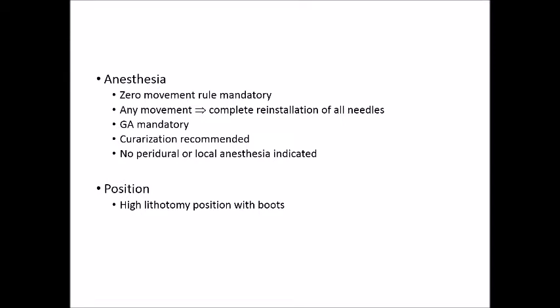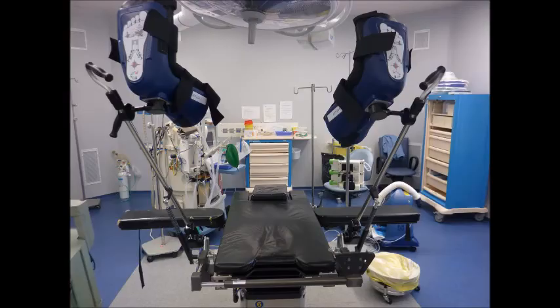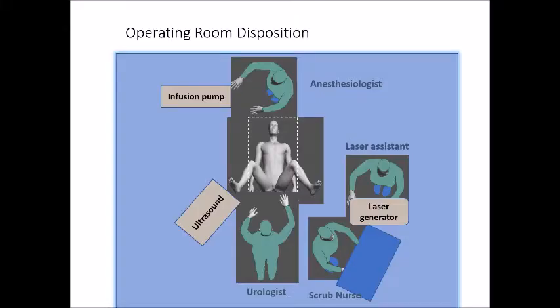The patient is under general anesthesia with zero movement tolerated, as we work at an accuracy of 0.1 mm. He is in high lithotomy position in an operating room. The patient is in the center in high lithotomy position under general anesthesia.